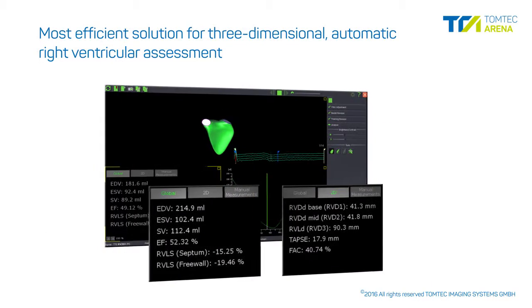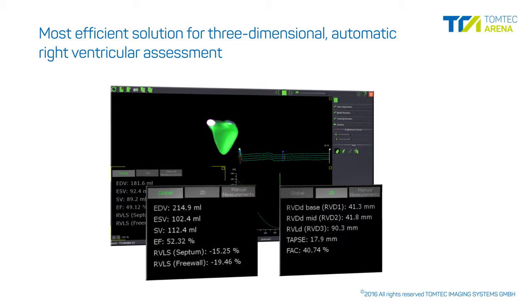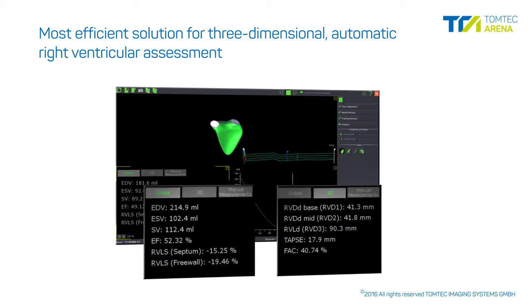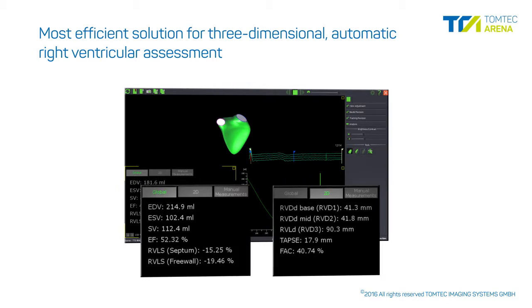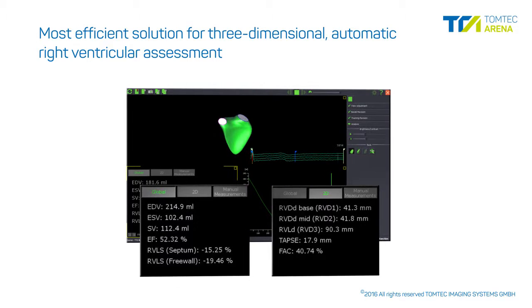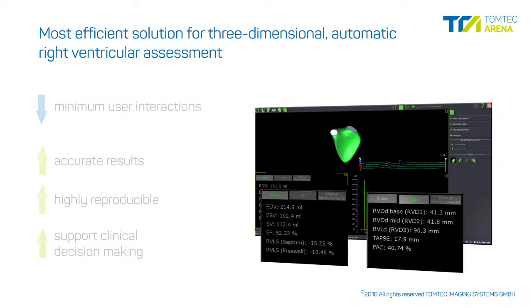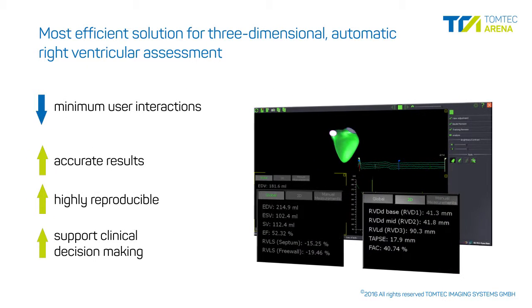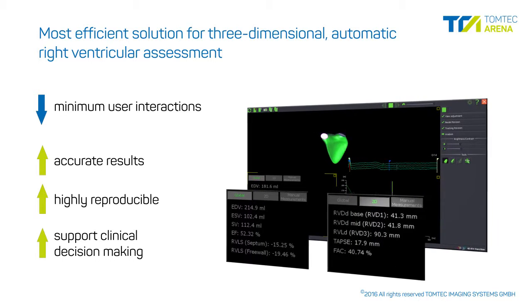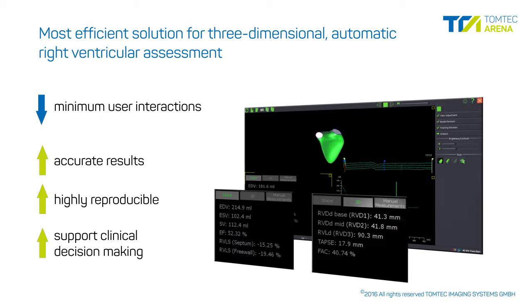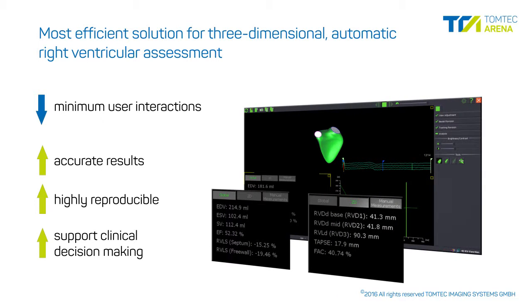4D RV Function is the most efficient solution for three-dimensional automatic right ventricular assessment. With minimum user interactions, results are accurate, highly reproducible, and support your clinical decision-making process.